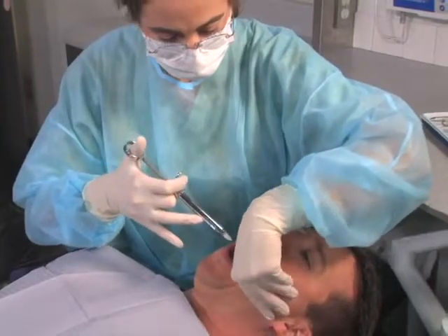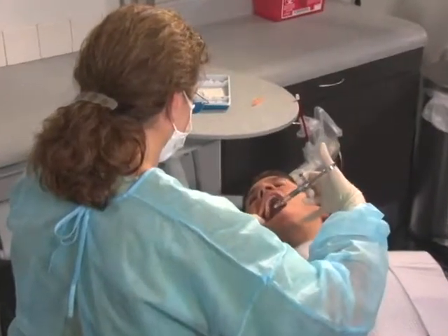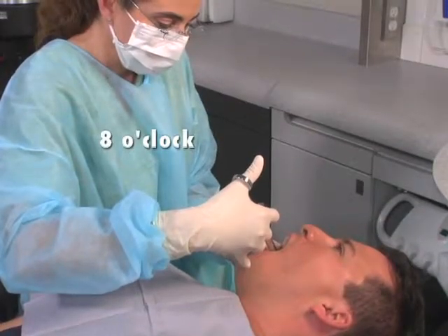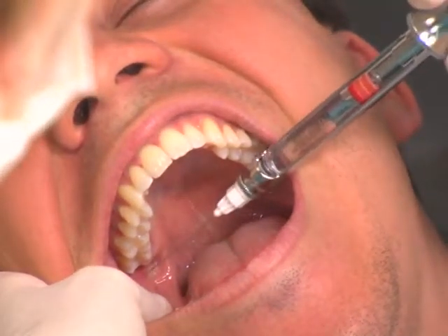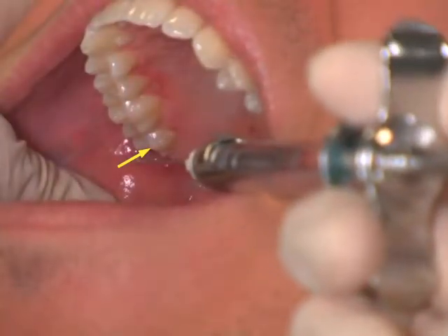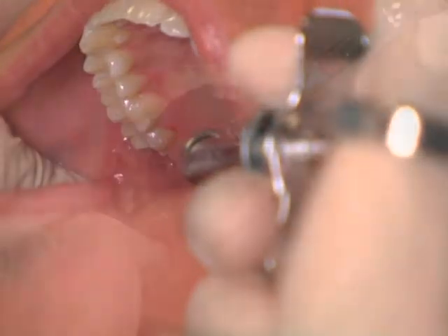For the left Gow-Gates mandibular nerve block, the right-handed operator should sit in a 10 o'clock position, facing in the same direction as the patient. For a right Gow-Gates mandibular nerve block, the right-handed operator should sit in the 8 o'clock position, facing the patient. The coronoid notch is palpated. The barrel of the syringe is placed in the corner of the mouth on the opposite side, and the needle tip is placed just below the mesiolingual cusp of the maxillary second molar. And then the needle tip is moved just distal to the second molar. This locates the insertion site for the Gow-Gates injection.